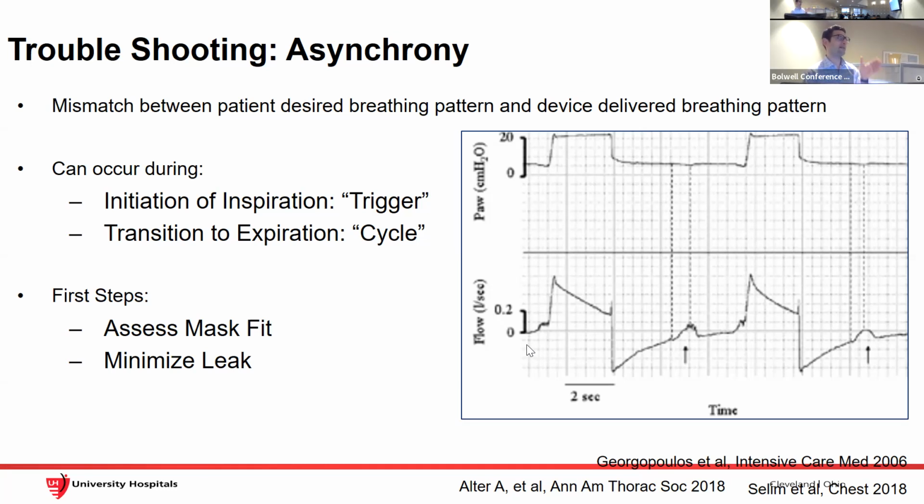I spent a lot of time in my studies lining, because I don't know, knowing what's inspiratory, what's expiratory. Sam has seen me do it in clinic. It seems I spend an inordinate amount of time answering that simple question: what's up, what's down, what does it mean? So here you see flow, and I did it when I was preparing this talk. I said, okay, what is this again?